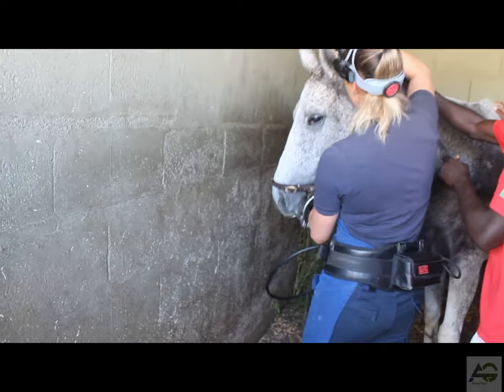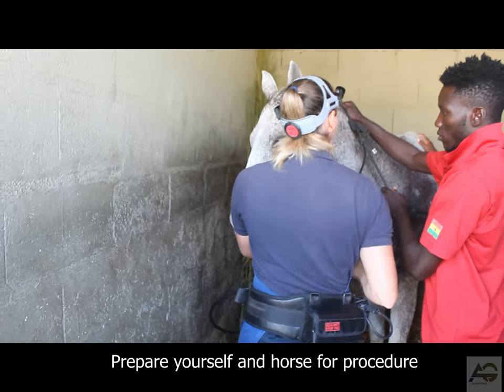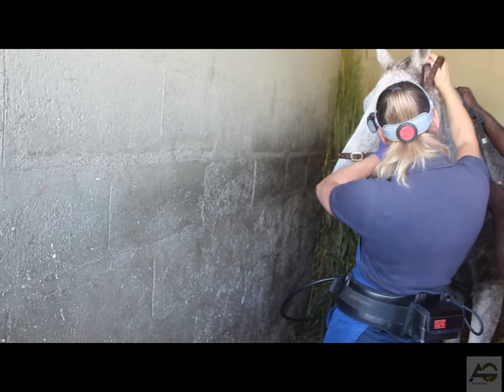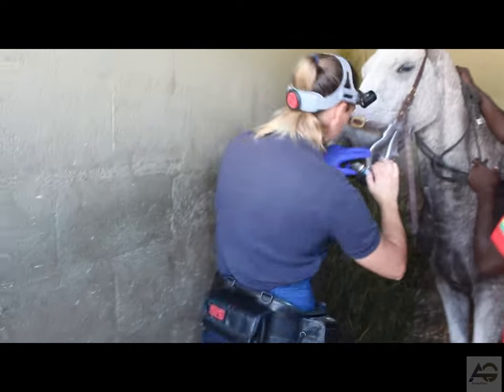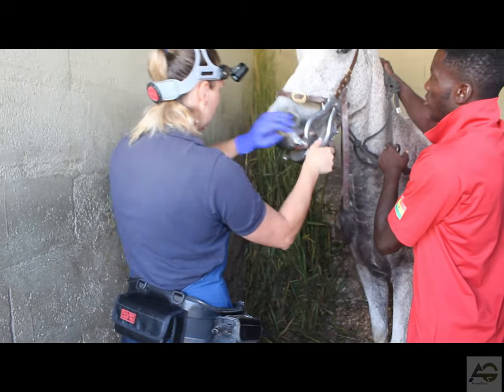Step 1: Preparation. Before you start floating a horse's teeth, it's important to prepare both you and the horse. Make sure you have the proper tools and equipment, including a floating tool, a halter and lead rope, a mouth speculum or gag, and a stable surface to work on. It's also important to approach the horse calmly and assertively to avoid causing undue stress.